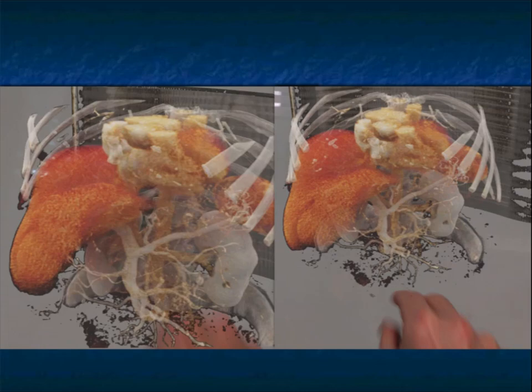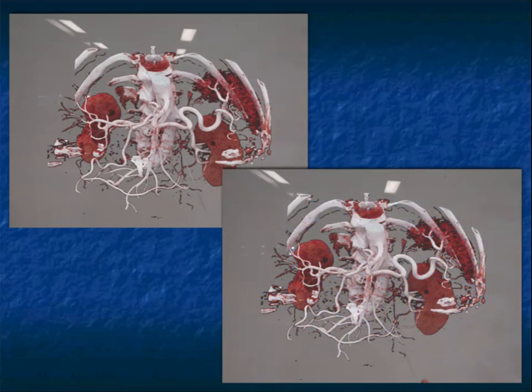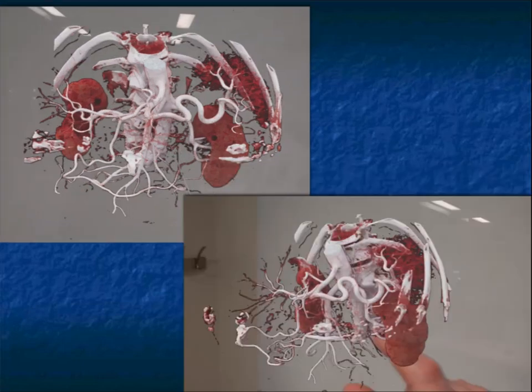Once you get used to the motion, one of the things you have to really learn is how to use the HoloLens. In theory everything is going to be voice command, but right now everything we've done is really with hand commands — you need to know how to pinch your fingers to move things closer, to expand, to take a picture. Everything can be done between touching one hand or the other, but it takes a while to get used to it. Here I've created the 3D imaging showing you the vessels nicely, showing you the accessory right hepatic off the SMA. This set of images is optimized for visualization of the vessels, and you can imagine for preoperative planning how valuable this could be.